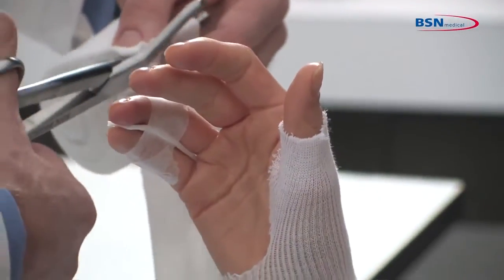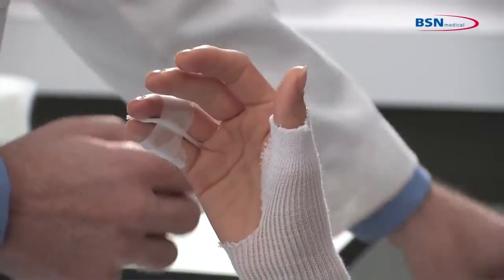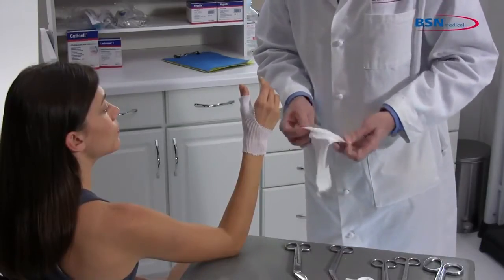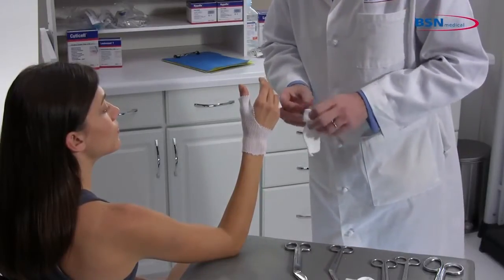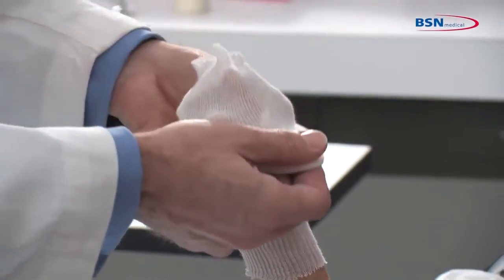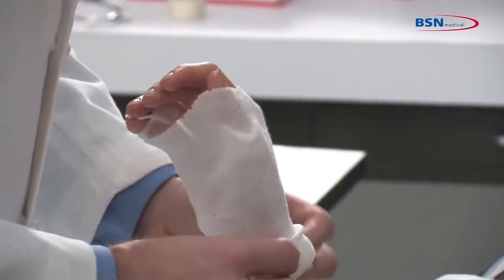Measure from the metacarpals to mid-forearm, allowing enough excess for foldback. Roll up the stockinette before applying to the limb to lessen pressure while applying. Roll on and remove all wrinkles and creases.